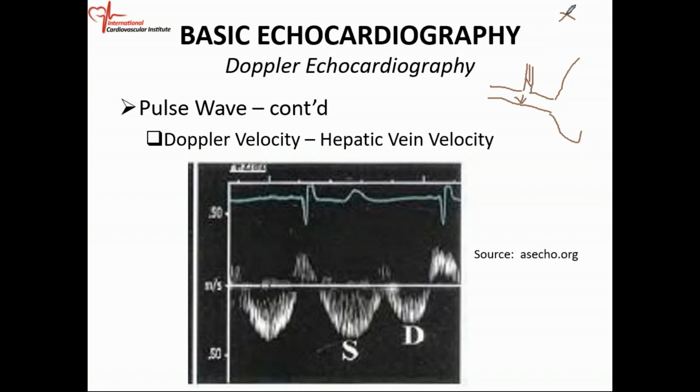So the blood is going to flow away from the transducer. Your transducer is right here. Okay. This is your liver right over here. So you should remember, your liver is right here.